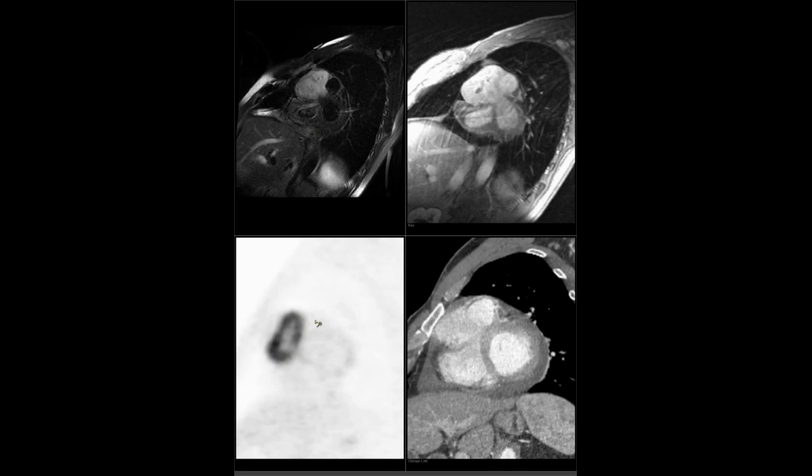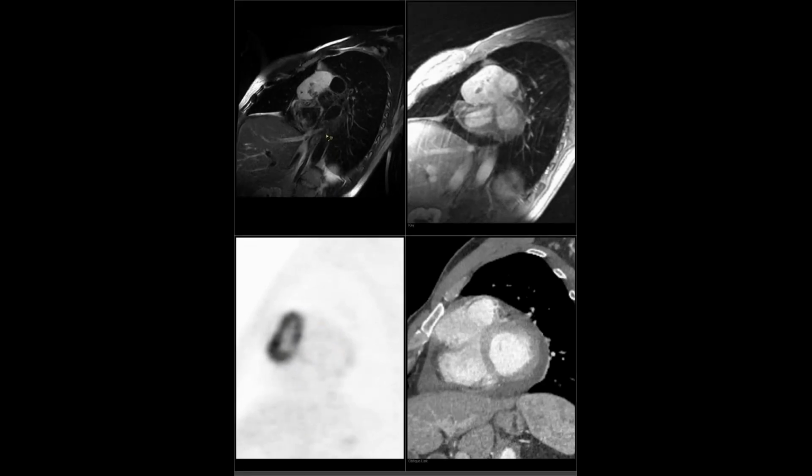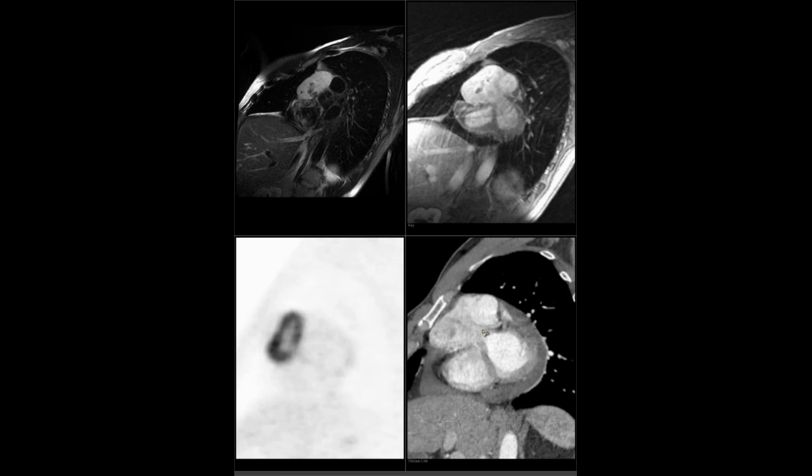Yeah, I would definitely get an MIBG study, because it looks like a paraganglioma. Or some really nasty vascular lesion. I've seen some high-flow vascular malformations, but they're not going to be bright on PET. But it's in a weird location for an angiosarcoma. Do you have a 4-chamber? I mean, it could be an angiosarcoma. It's just a strange location for one. How fast does it perfuse? Yeah, let me pull that up.